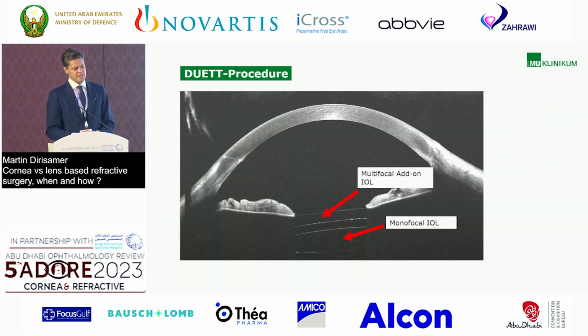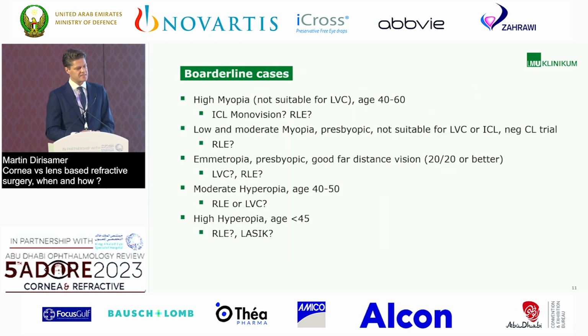Here's this OCT, you can see it very nicely. And these perform similar to normal trifocal IOLs. So there is really no difference, at least not published and at least not in our hands.